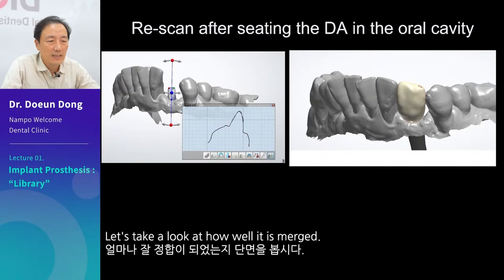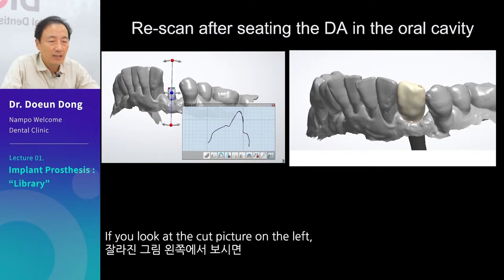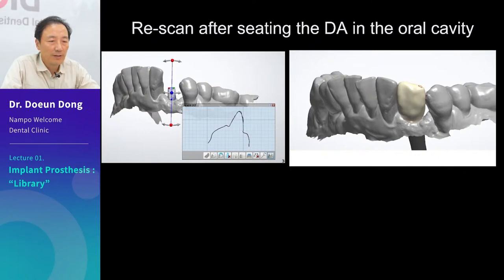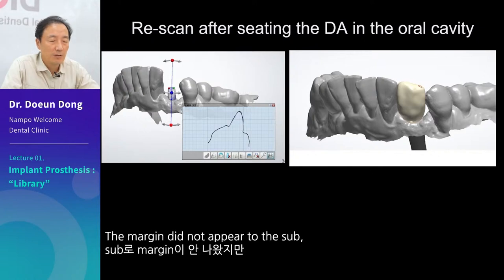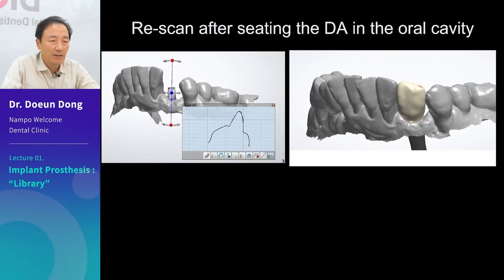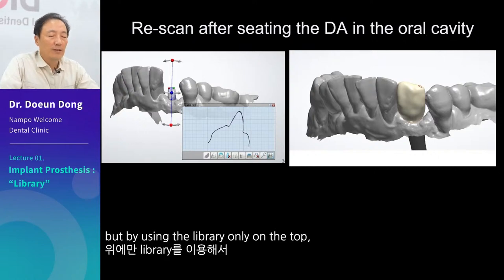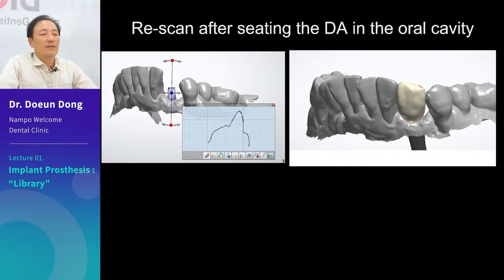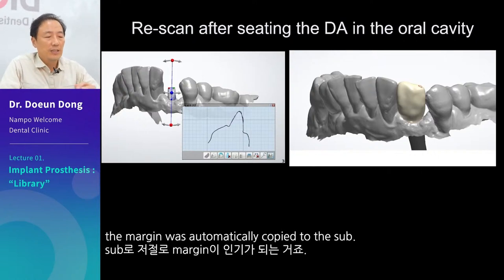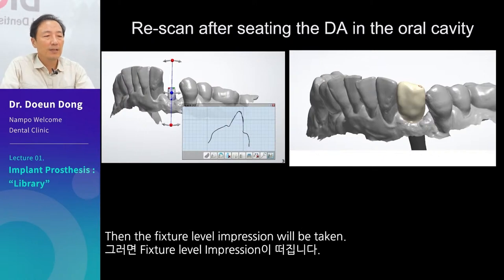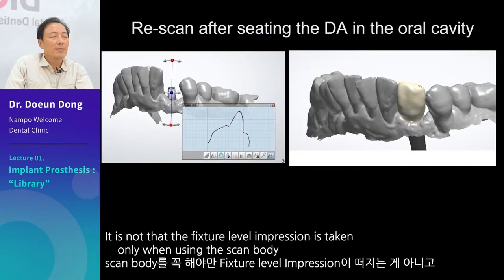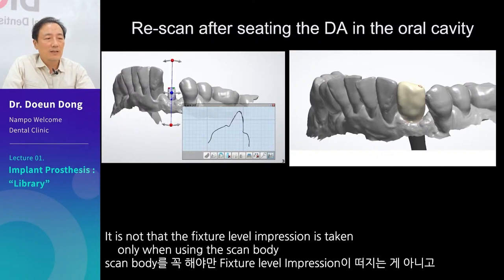Let's take a look at how well it is merged. If you look at the cut picture on the left, it is fitted very well. The margin did not appear to the sub, but by using the library only on the top, the margin was automatically copied to the sub. Then the fixture level impression will be taken. It is not only taken when using the scan body, but also when a digital abutment is worn.